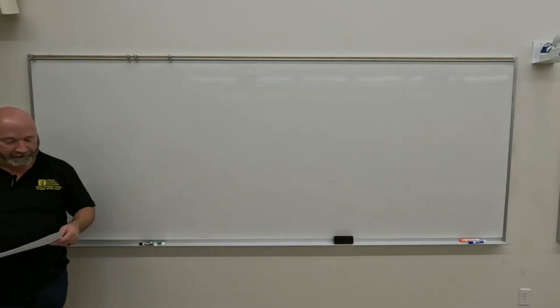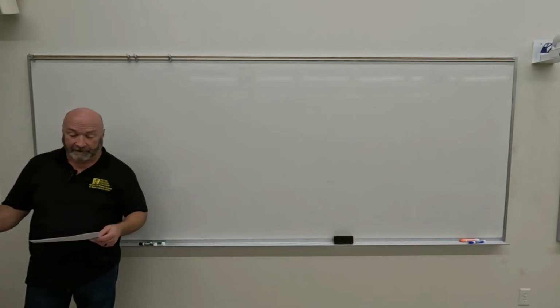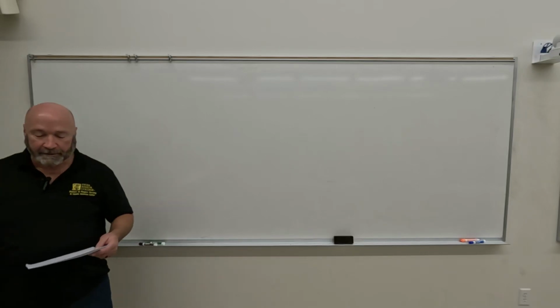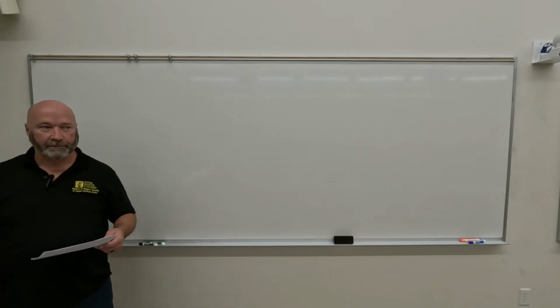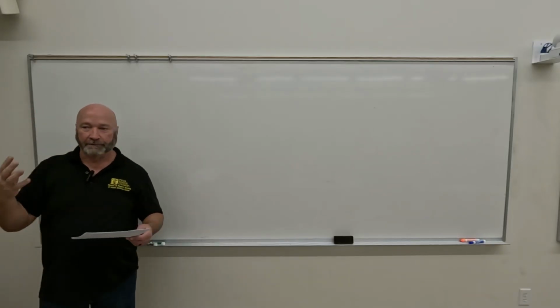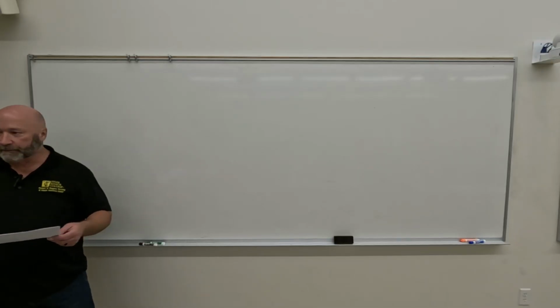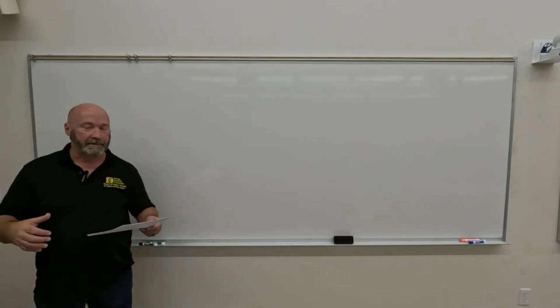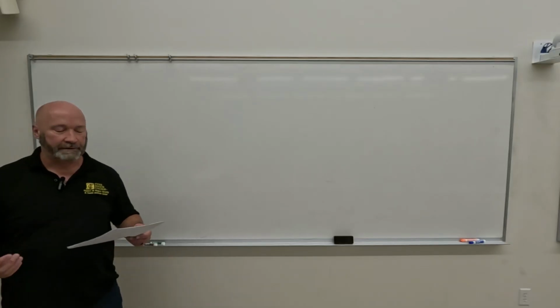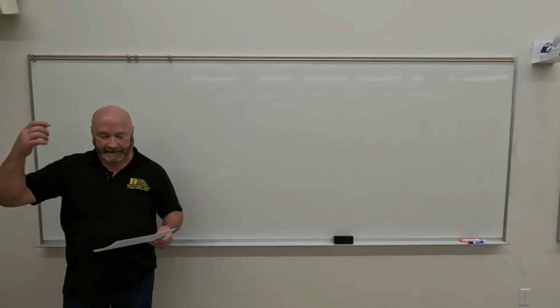So just to review what we did on Friday, we talked about the external components. So we talked about support systems. We talked about the different types of support systems, most common of which and the most flexible would be the ceiling mounted systems, and those are the systems where you've got two sets of rails, 4 rails that are mounted perpendicular to each other, and then the overhead crane with the X-ray tube on it suspends from those so that you can take those anywhere in the room and you can angle it in any direction, rotate it in any direction.